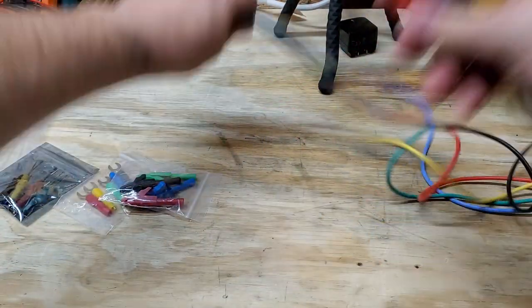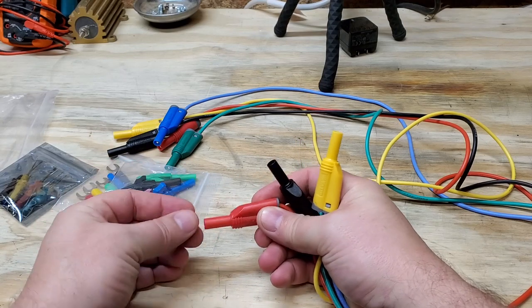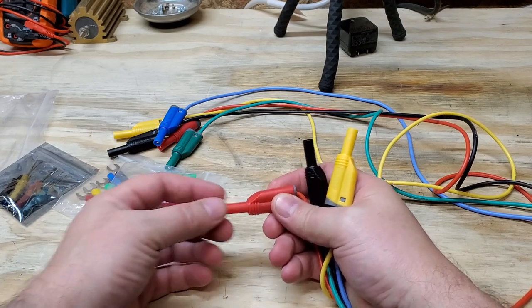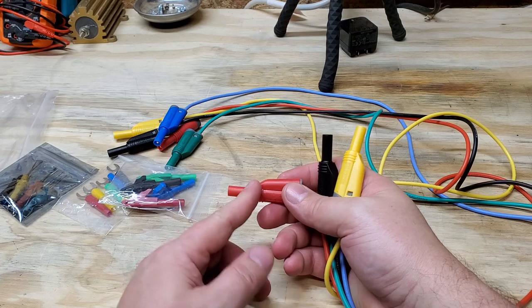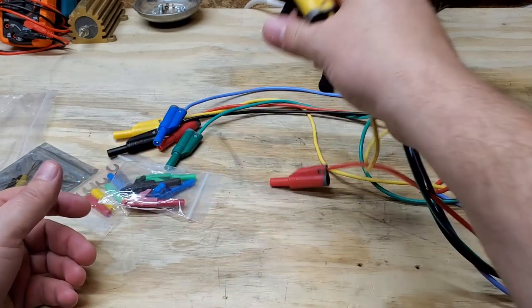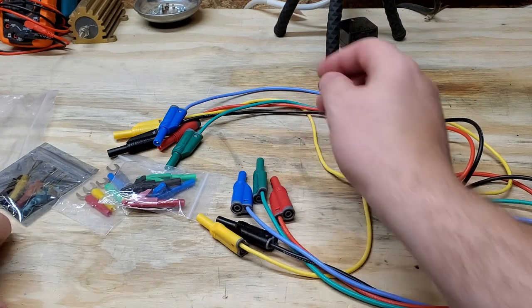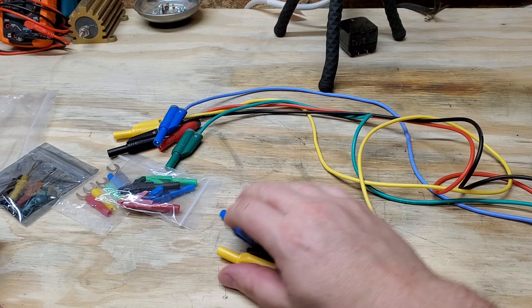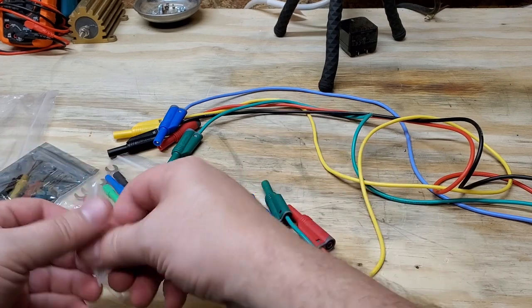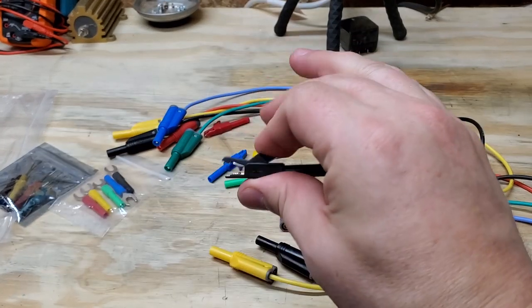One of the important features of these cables is that they have the safety shroud. Now it's not a collapsible safety shroud like with a lot of the Fluke cables, but it is still there. So if you inadvertently leave it hanging while connected to an ESU or something, it's not going to ground out. These are really nice.